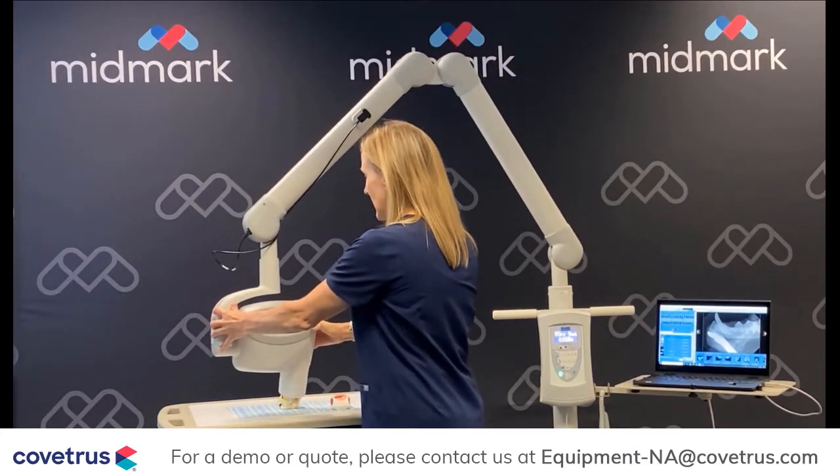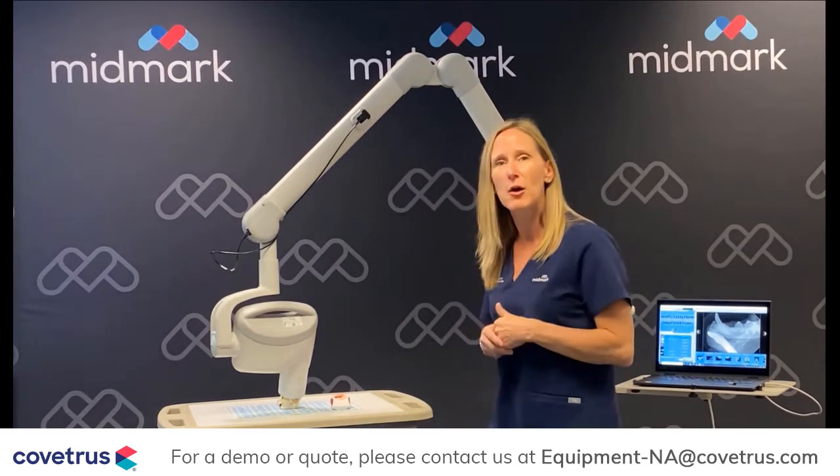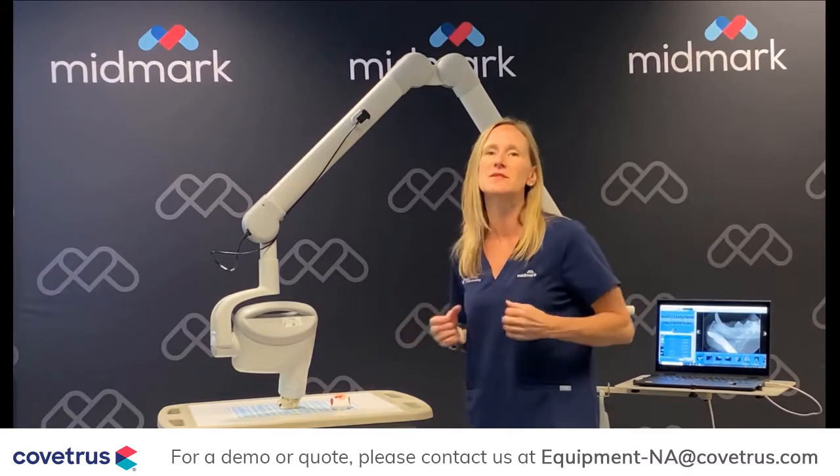So if you can, get your hands on one of these and try to move that arm around — I think it'll help make a decision for you. We've got frictionless joints in the arm as well. You see how smooth that was to move around.